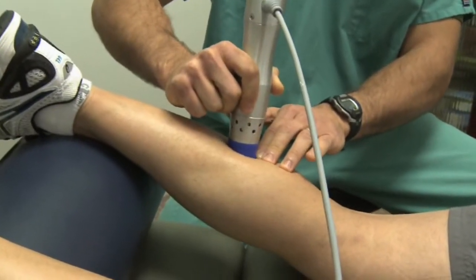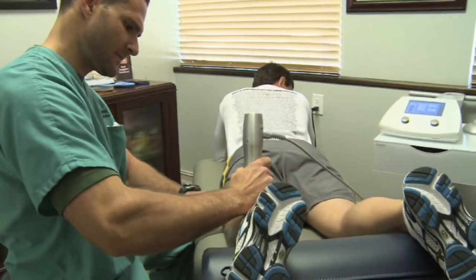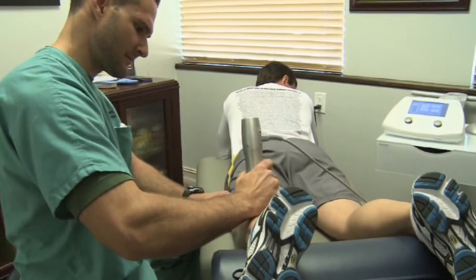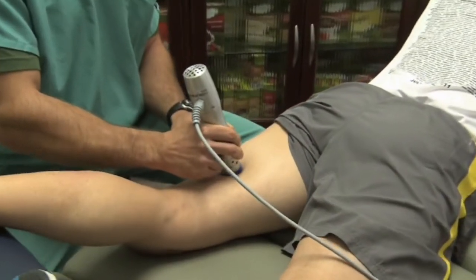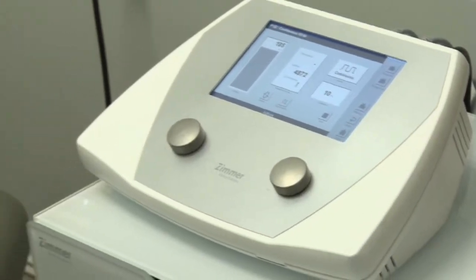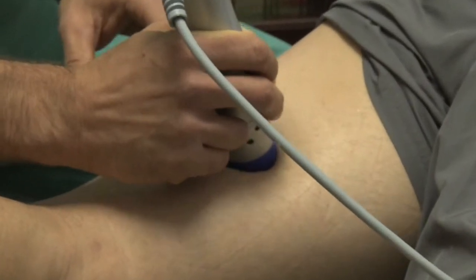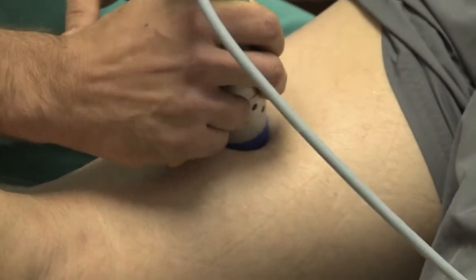Chronic injuries don't heal very well, so it needs to have that inflammatory response triggered. So we create a small tissue trauma, a small tissue insult, to help stimulate that healing process of something that has kind of lost the battle and walled off the area with this dense, thick scar tissue. By hitting it so many times, it really tenderizes or softens up the muscle, but at the same time, it's bringing a lot of blood flow to the area to stimulate the healing response in a controlled way to help it re-heal, which is truly amazing.